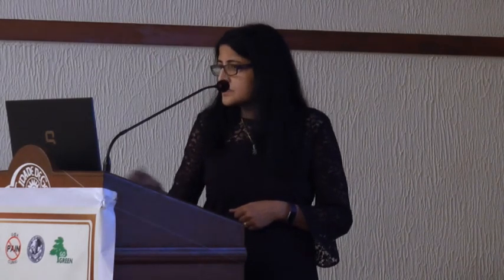Now don't forget this corner pocket which lies between the subclavian artery and the first rib. This is a common hiding place for the ulnar territory. It's also called the 8 ball for the inferior trunk. Over here again you can see a good spread of your local anesthetic around the entire brachial plexus.